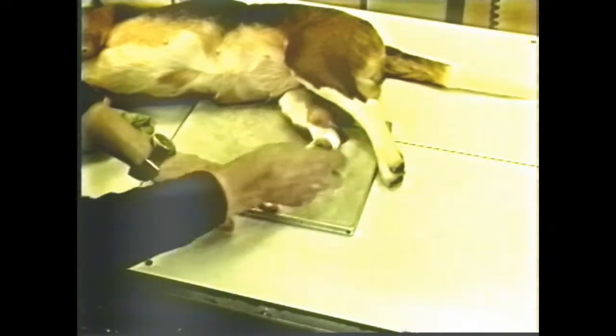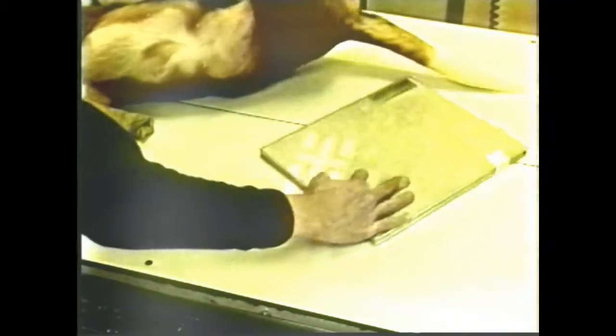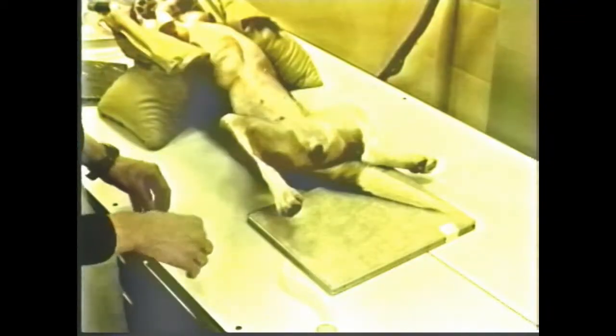Following the exposure, when the leg is removed, a tape is then placed on the edge of the cassette, indicating the end of the cassette that has been exposed, and that tape also marks the toe end of the extremity.